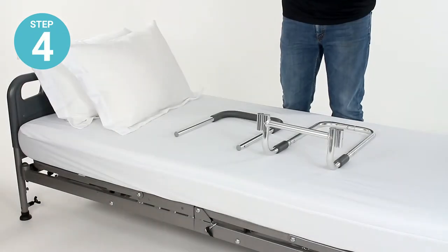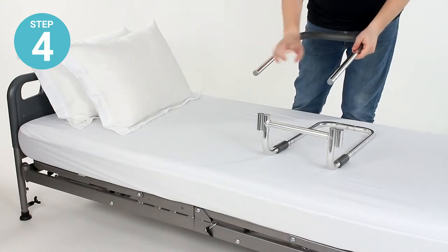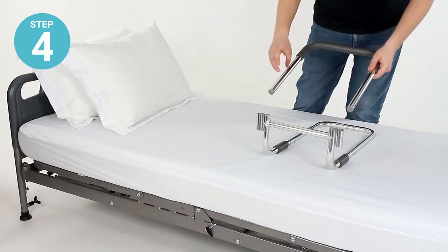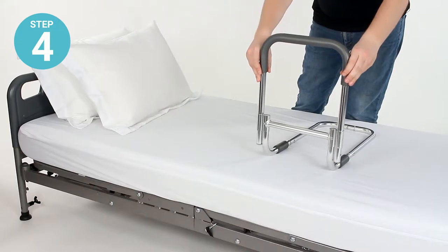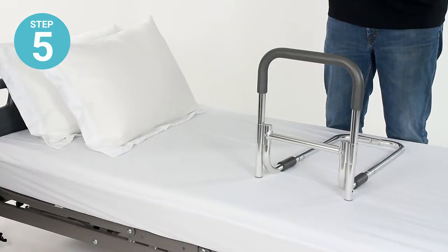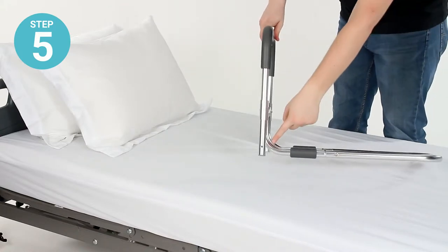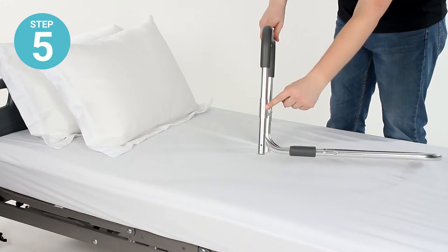Step four: take the padded hand rail and fit the metal ends into the outer, open tubes on the crossbar. Just fit those down and run those through. Step five: turn the rail so that you can see the pin holes at the bottom of the grip rail and on the crossbar.